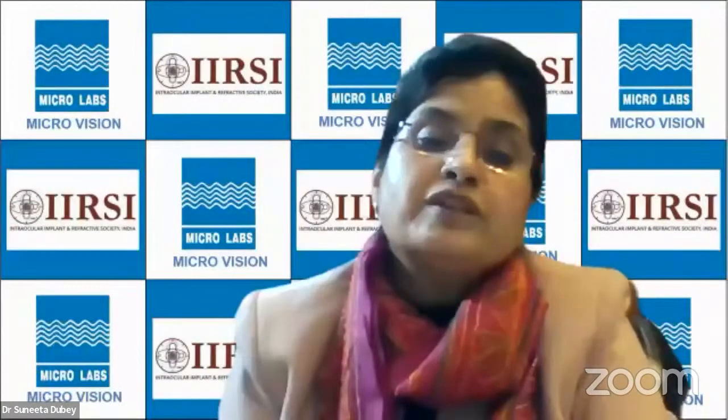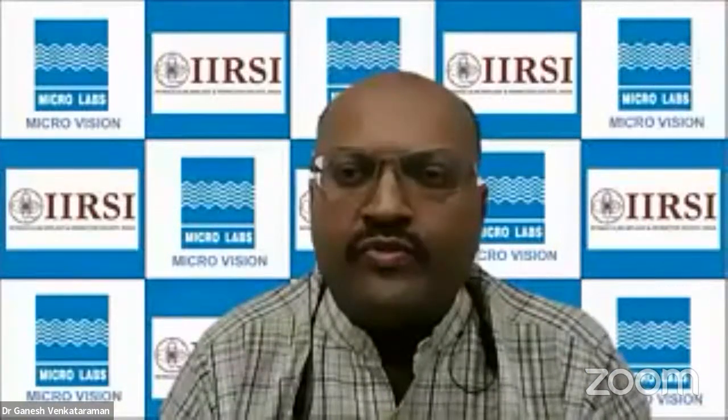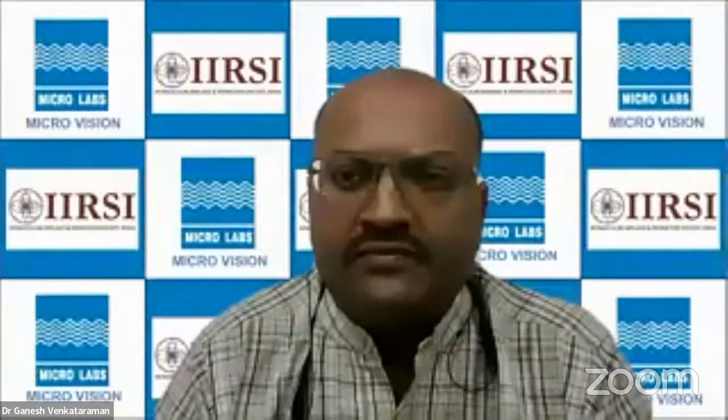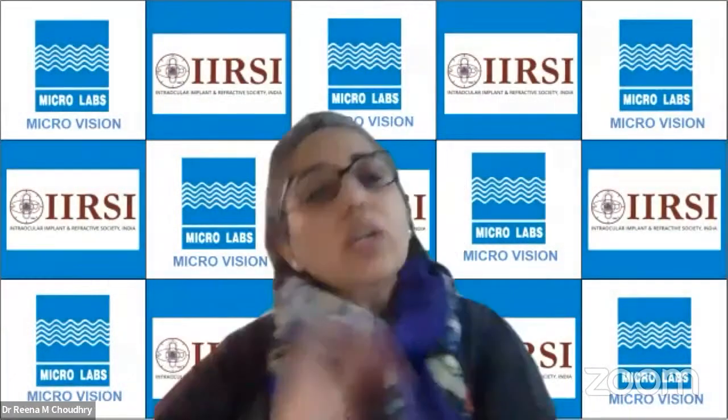Okay, so once you have the... How much concentration of mitomycin C? We inject 0.1 cc of 0.2 milligram per ml. So the delivery is 20 micrograms. 0.2, yeah, I think so, that's the amount. And then you use a 26 gauge needle.